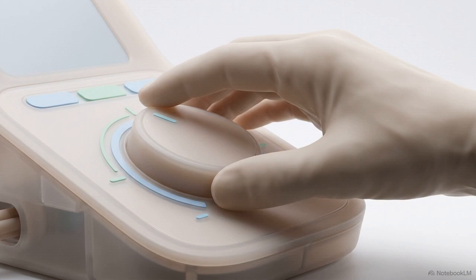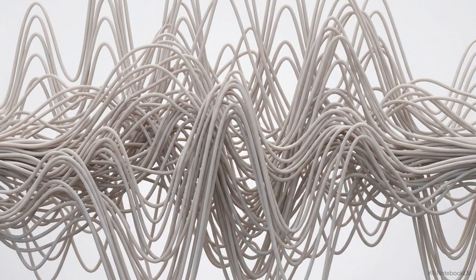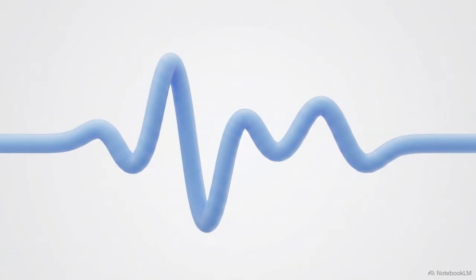By simply scaling up the decibel volume and observing the resulting timeline behavior of these waves, a clinician can definitively separate a mechanical fluid blockage from a structural neural tumor. A final ABR result is never a single reading. It is the highly filtered, averaged response to several thousand repetitions of broadband acoustic click stimuli, designed to isolate the true neural signal from background noise.